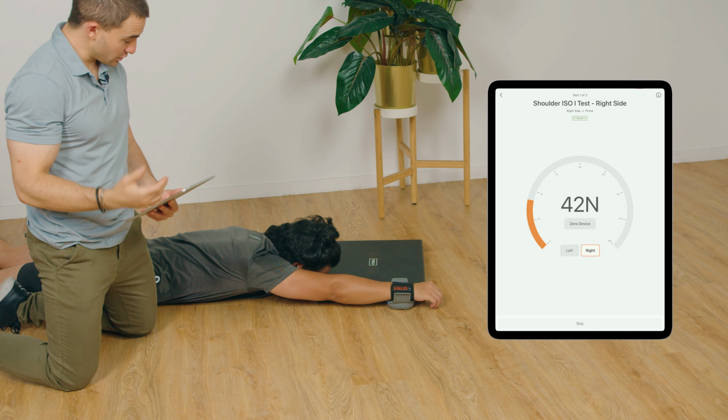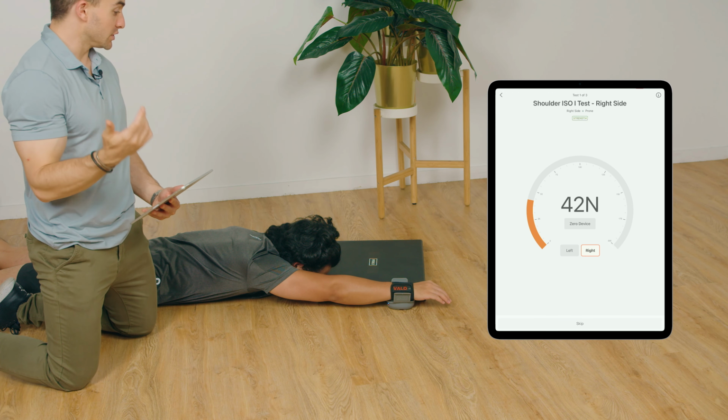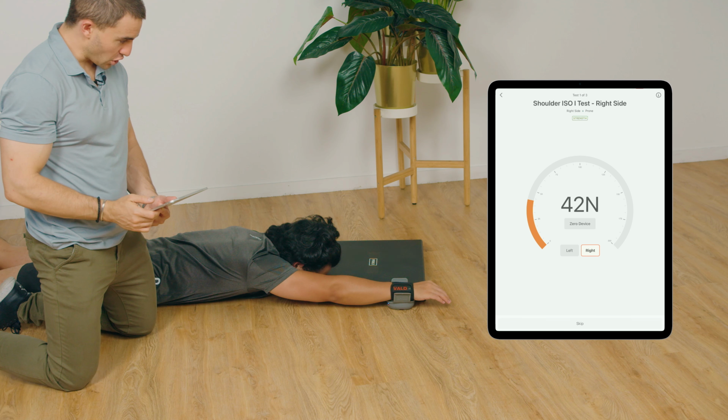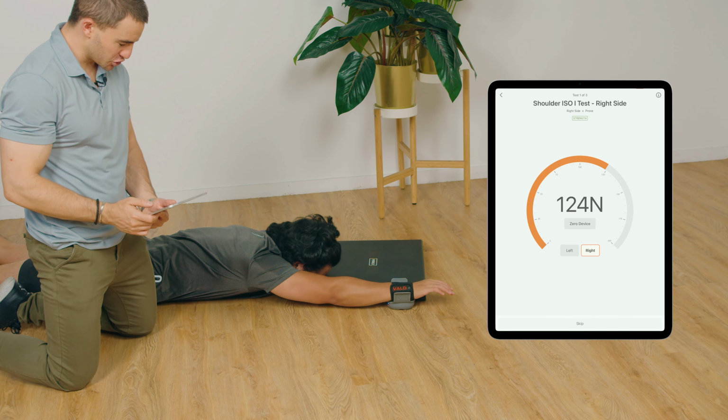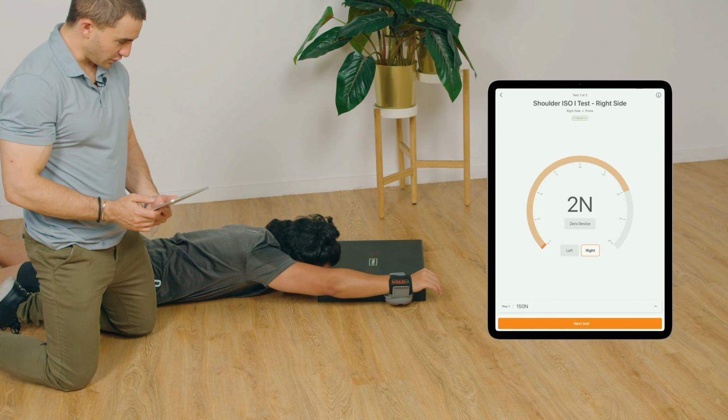Now, when I say go, again, looking just at peak force, not rate of force development. Cal, I want you to build up force, applying as much force into the ground as you can. 3, 2, 1, go. Push, push, push, and relax. Lift your hand up so we measure the rep. Good. And perfect, relax back down.